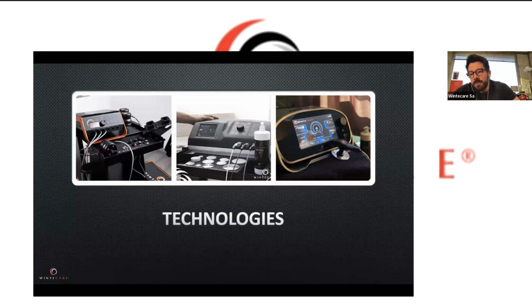The communication between the handpiece and the control unit is based on the impedance between the tissues, between the electrode and the plate, and knowing which electrode you are using and the temperature of the tissue, it adjusts the level of current that you need.